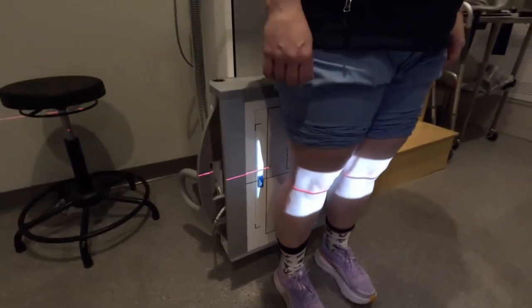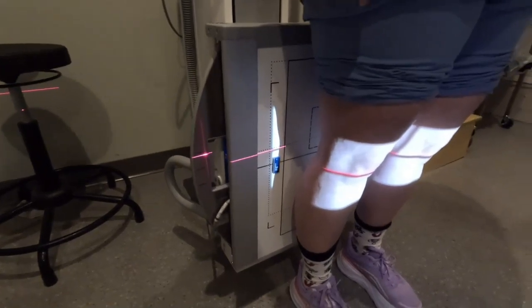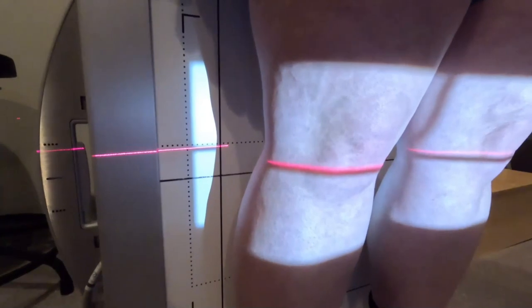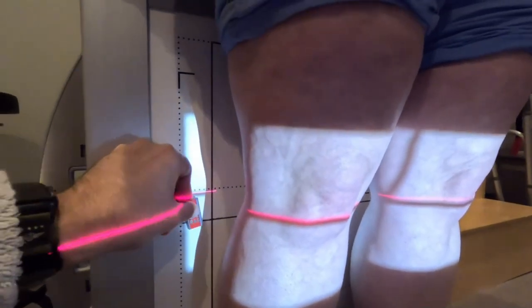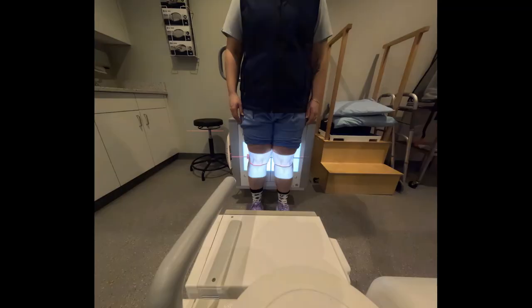So the only thing left to do, a couple things, we just have to reset our board to center it, which if you're setting a technique isn't completely necessary, but we definitely need to switch our marker here because we're turning them around. So now that's the right knee. It's extra important to make sure that your patient stays centered so both knees are on the image if needed.